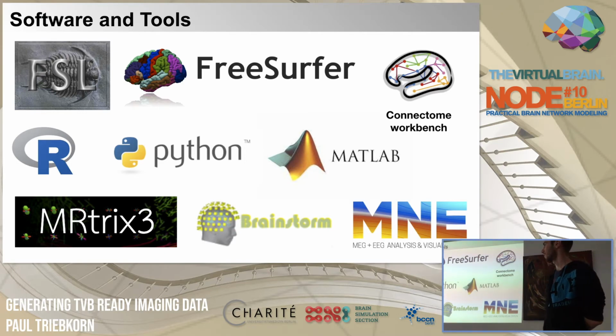MRtrix, the software we are using for streamline tractography, has all these advanced artifact correction methods, different streamline algorithms, anatomically constrained tractography, as well as, after tractography, the filtering of the tractogram. Brainstorm and MNE are different software packages to use to construct the forward model or inverse solutions for your MEG or EEG.